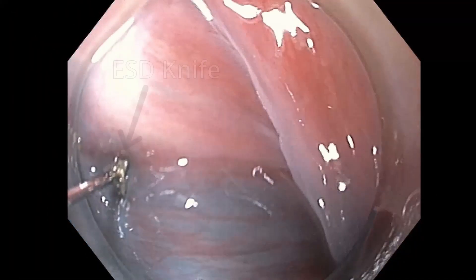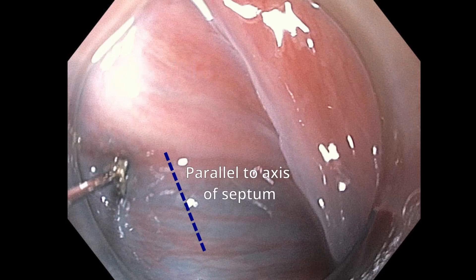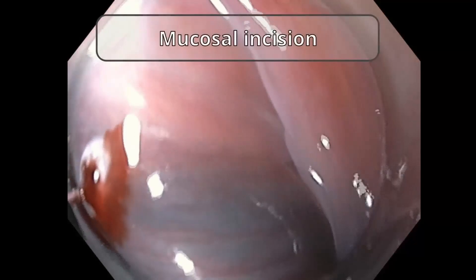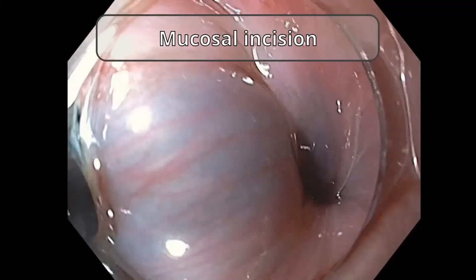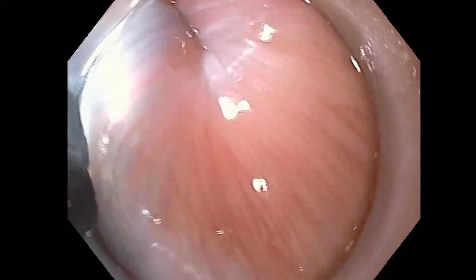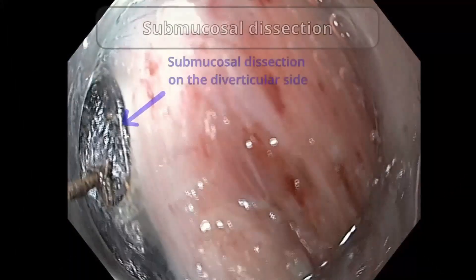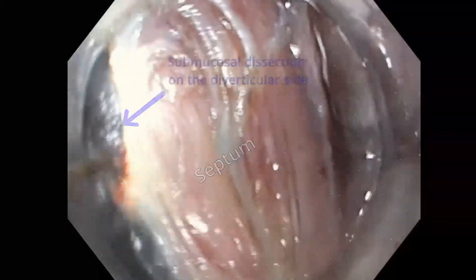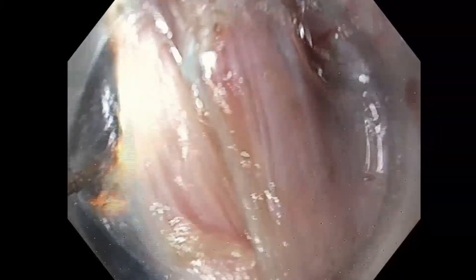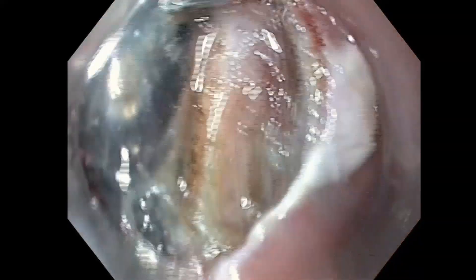After submucosal injection, a mucosal incision is made parallel to the septum axis. This is followed by submucosal dissection performed on both the diverticular and esophageal sides. The submucosal dissection on the diverticular side is carried out to just distal to the base of the Zenker's diverticulum.